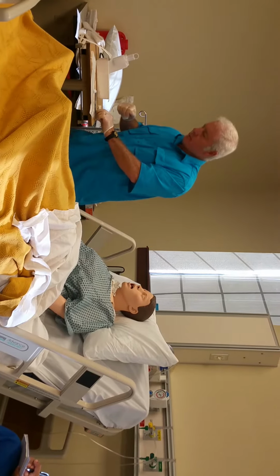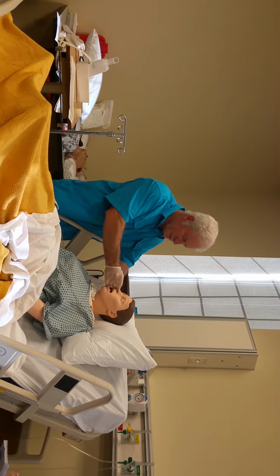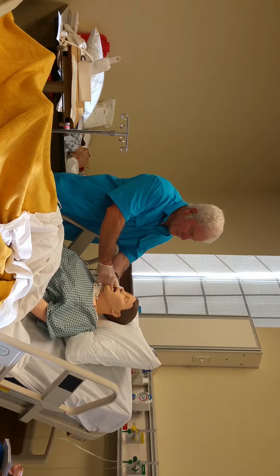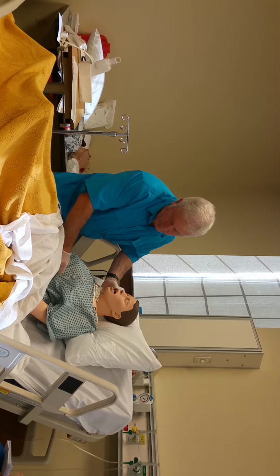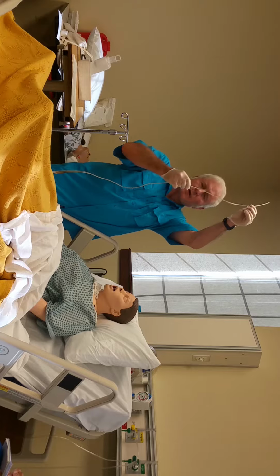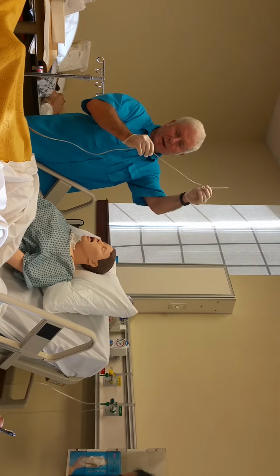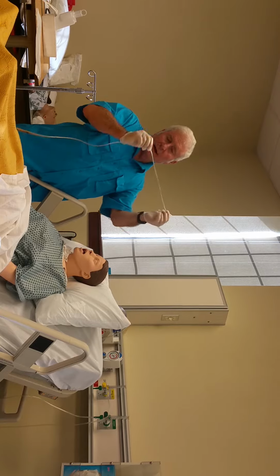I've got my Sharpie, and I'm going to measure his nose to his ear. I'm going to take my Sharpie and make a line around there, okay? And then I'm going to measure from his ear down, I keep saying his xiphoid process, which would be about here. But notice there's a black mark there, so we're going to pretend that's the mark, okay, just so you can see it, since I don't have a Sharpie, all right? So I know I need to go that far to that mark. In reality, I need to go down to here.